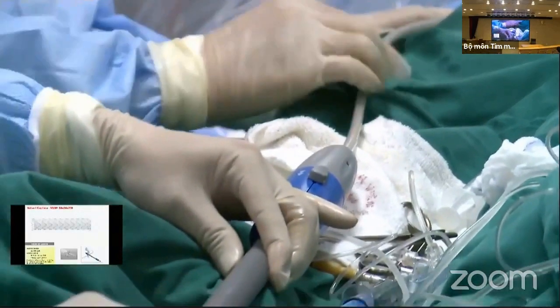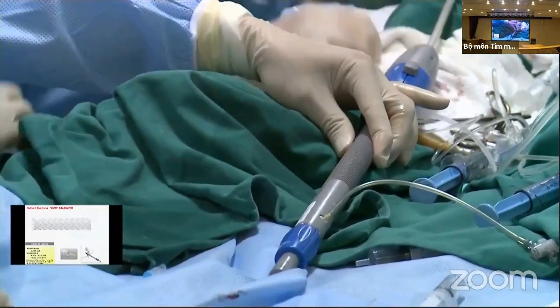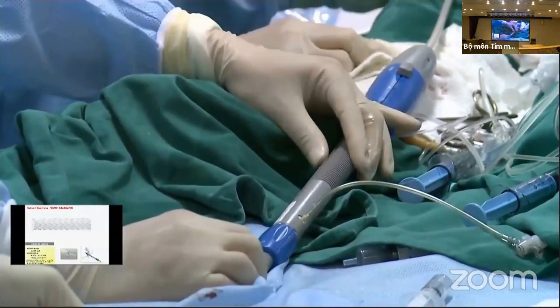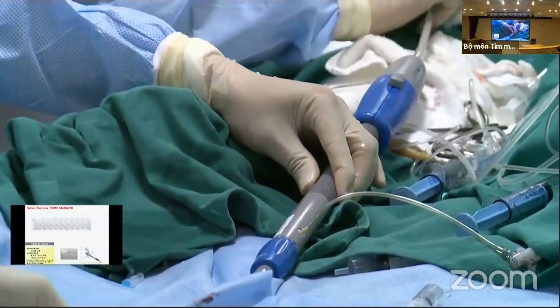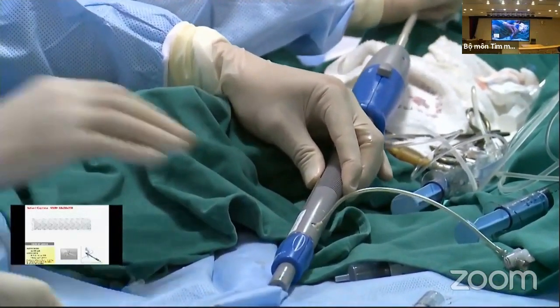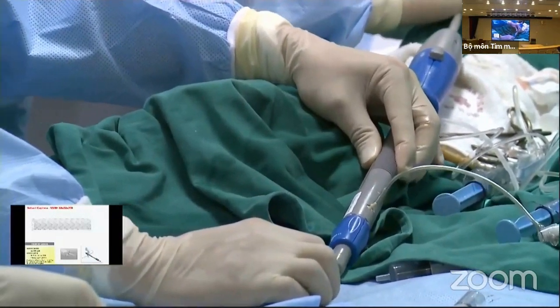Now you can see we advance. What's the French size of the device? This is the 22 French. 22 French. Yes. And you pre-closed it in a crisscross fashion, I gather. Yeah.